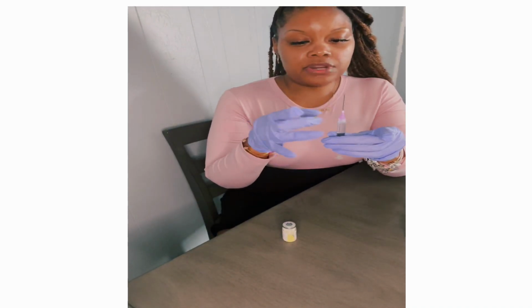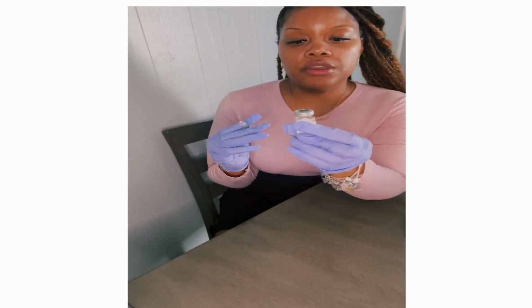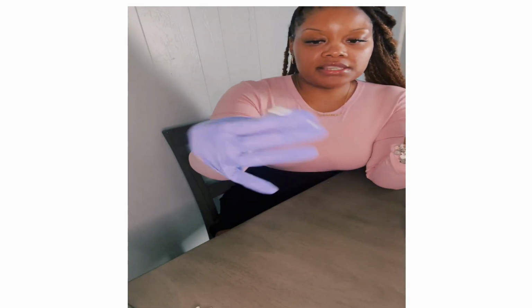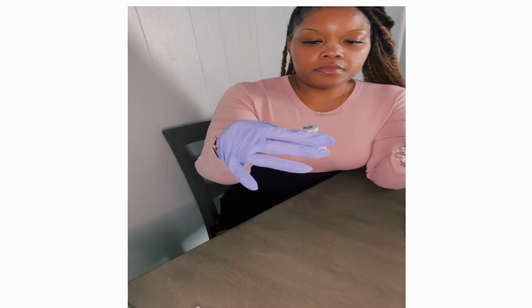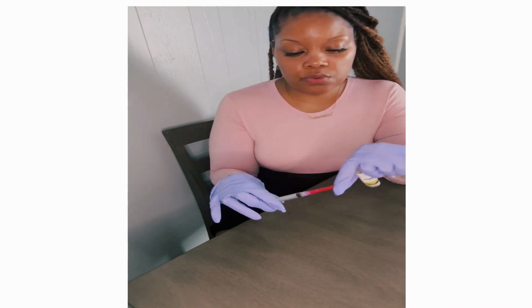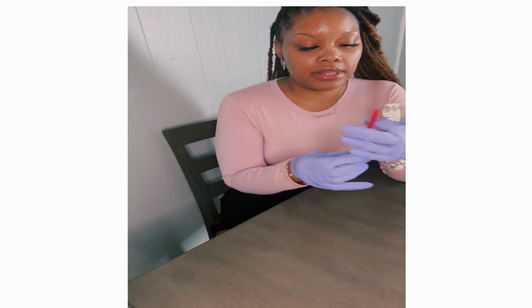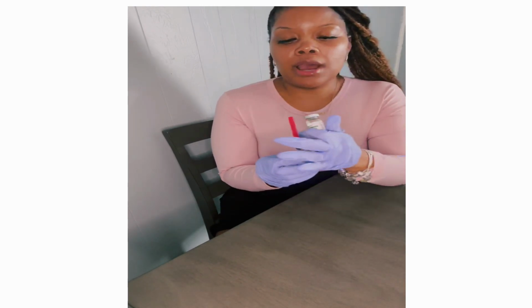If I got any bubbles, I'm going to get that out. All right, so then this is our medication. So then we're going to add this 2.2 mLs of sterile water in. Make sure that you turn your medicine and mix it up. So we're going to take our same needle, because I didn't show it on camera, but what I did was, we don't recap needles, but we can do the little scoop method. So what are we going to do? We're going to clean the top of this hub, and then we're going to go in and draw our medication.